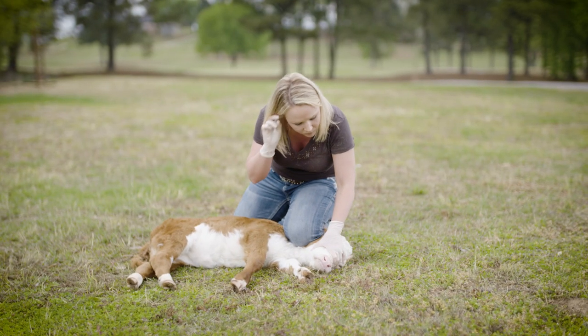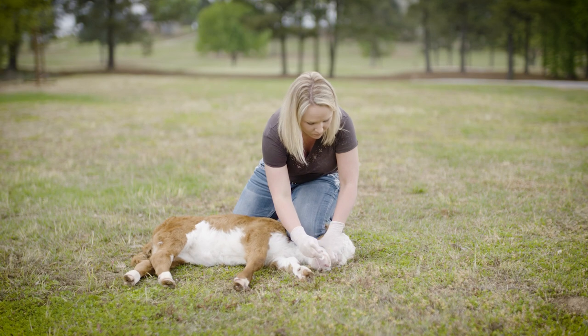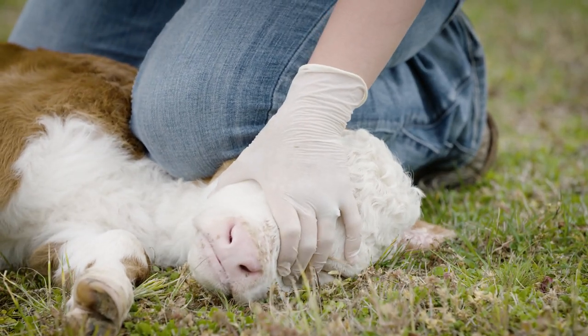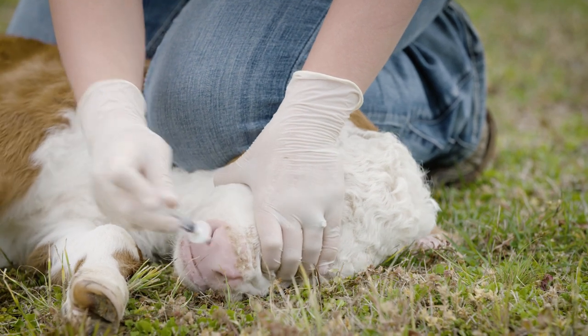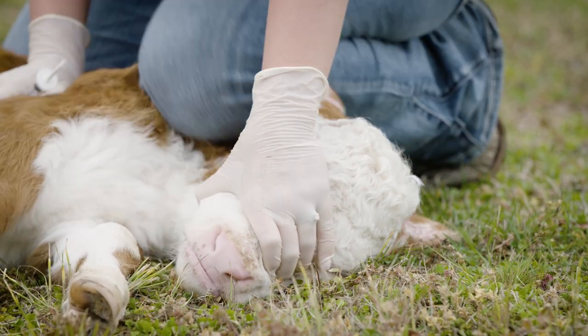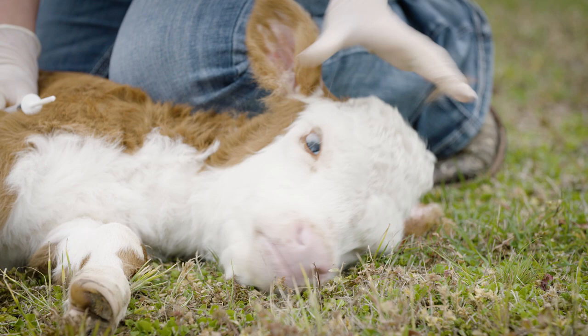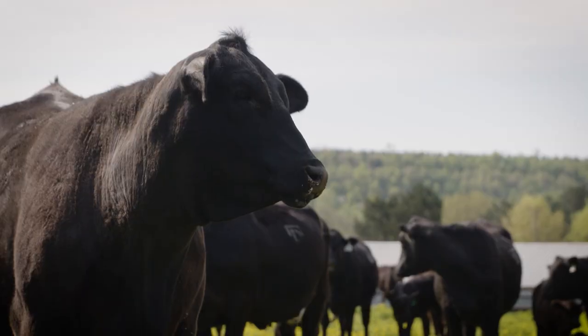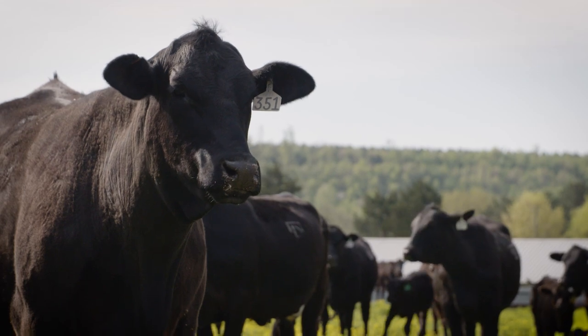Young calves may be too small for a typical headgate in the chute. In this case, you may need to restrain the calf by hand or on the ground and administer the vaccination with a small syringe and cannula. Make sure not to extend the calf's head and neck upward, as this opens the windpipe, increasing the chance of fluid going into the calf's lungs.